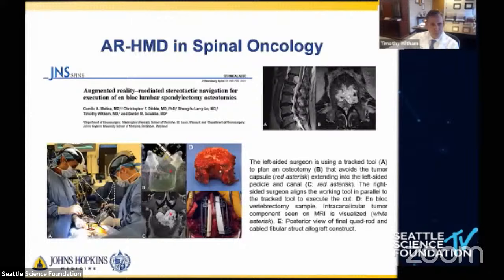It's interesting to place instrumentation using this technology, but really, it's going to have to do more than that. And I think a lot of the platforms are going to have to do more than that. So things like tumor resection, planning osteotomies, navigating interbodies, these are things that are going to happen in the future. And so this is an example of a paper we published. My partner, Dan Shuba, used the technology to plan his osteotomy cuts to remove this L1 chordoma. And it was very useful in that instance for them to do that.